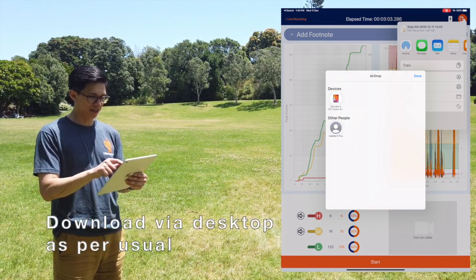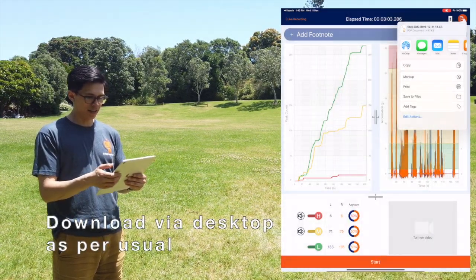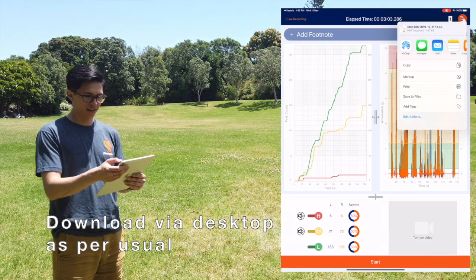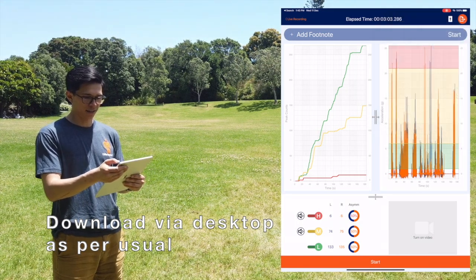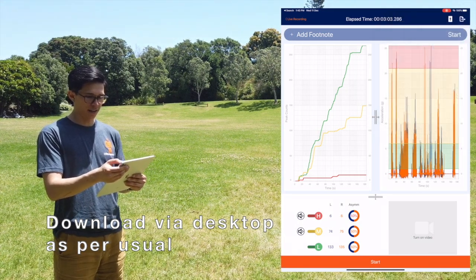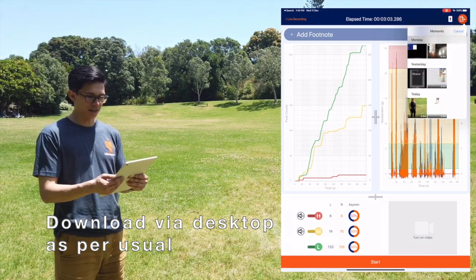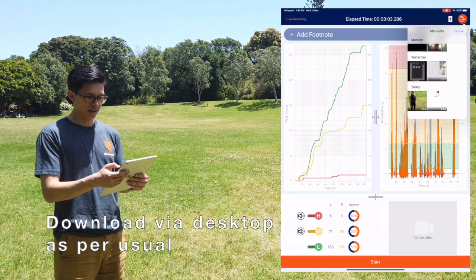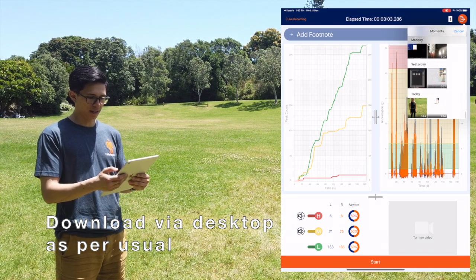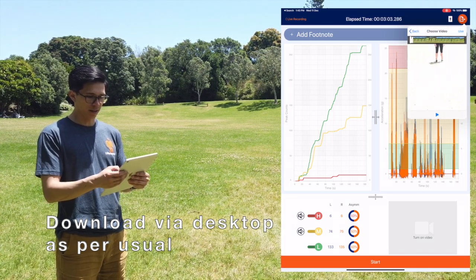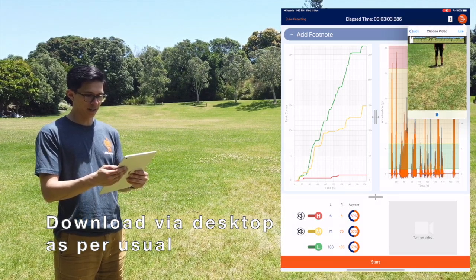Note that your sensors have recorded the raw IMU data to the sensor just like a regular recording, and your session should be downloaded and uploaded via IMUStep desktop to view IMUStep metrics in the online dashboard.